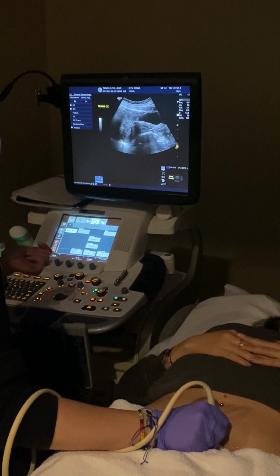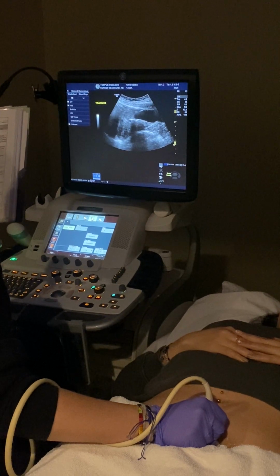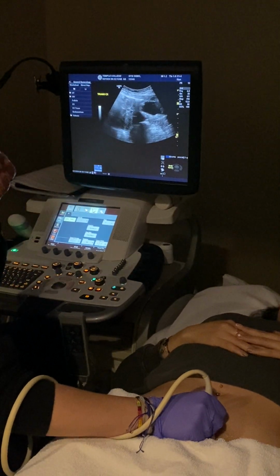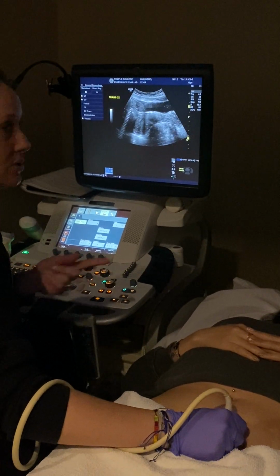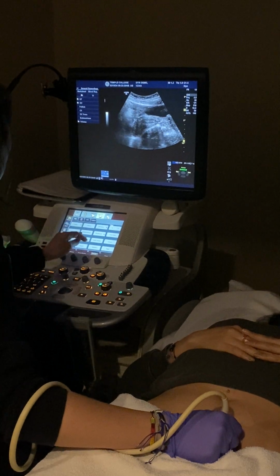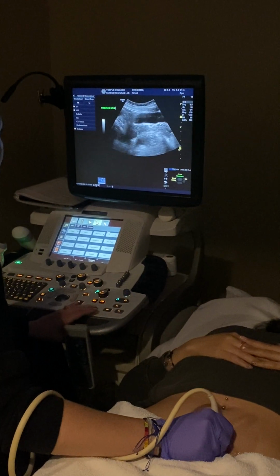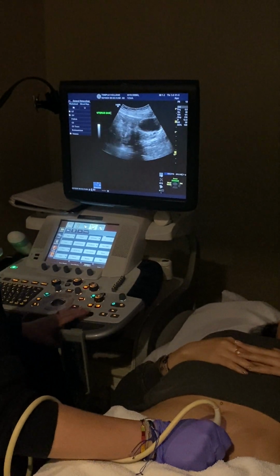All right, so when we're doing the uterus evaluations, I think you guys are just doing like a right to left. So these are your sweep images. And you can give me a right, a midline, a left. That's fine, as long as you show me you've evaluated it. But those of you that have been with me and watched me scan already, if we're doing a uterus evaluation from right to left, do I just want that, and then that, and then that, and that's it? No, give me a little bit more, okay? Show me that you've evaluated it.